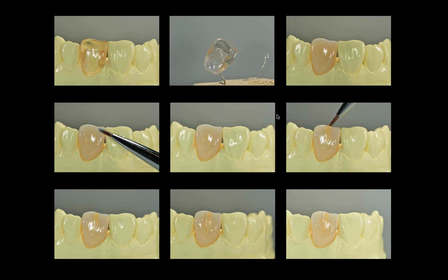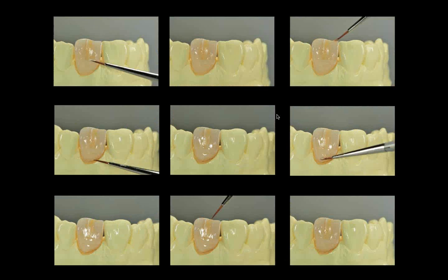So for me, that says, okay, if something looks white, it'll never be nicely chromatic after I've melted it, after I've crystallized it. So by doing the polishing process, I get much more depth. The crown looks deeper. The crown looks somehow more chromatic. And that's why I try to polish it before I crystallize it.